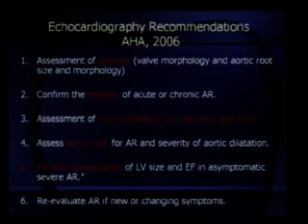If the patient is asymptomatic, and the LV end diastolic dimension is not too high, then you can reevaluate the patient for LV size and ejection fraction in asymptomatic severe aortic regurgitation. That's one of the questions in aortic stenosis, but it equally applies to aortic regurgitation. That is one of the strengths of echocardiography, periodic reevaluation.